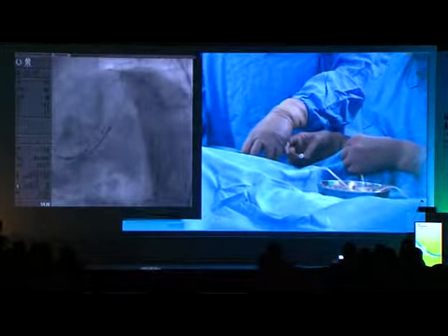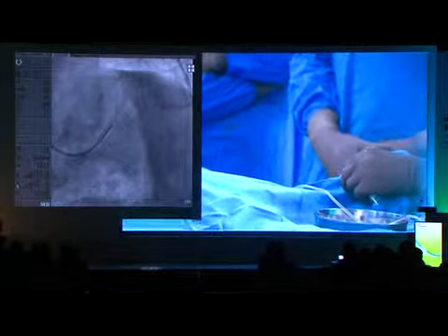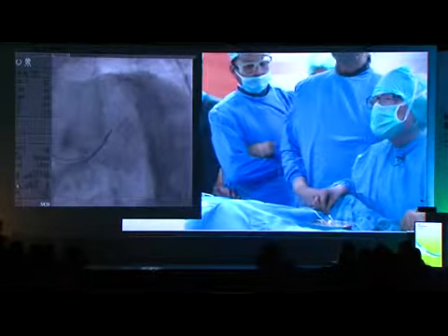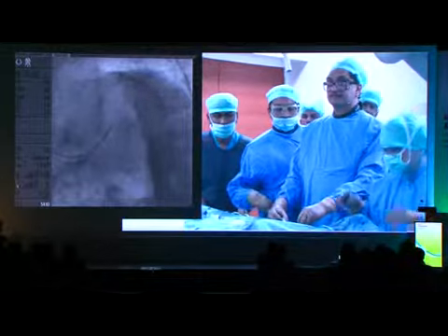Okay, so what's next? Which do you want? Cross it? Or, Mary, would you like to change the wire now? Yeah, we are changing the wire. I will change. Mary, this is Dr. Ashwin Mehta.